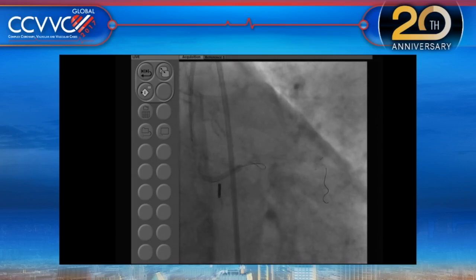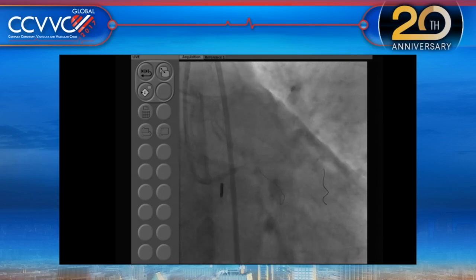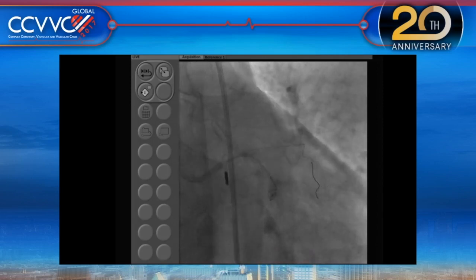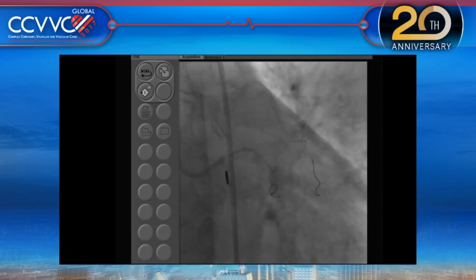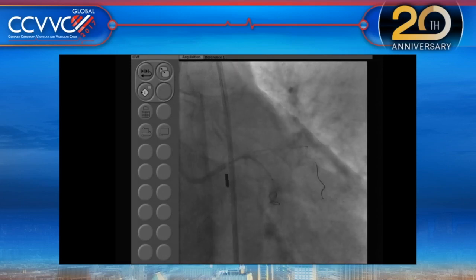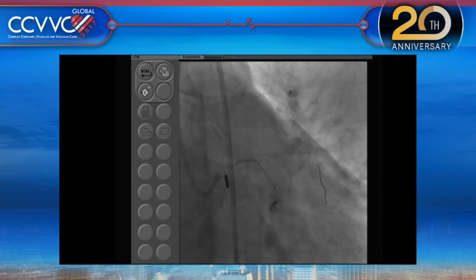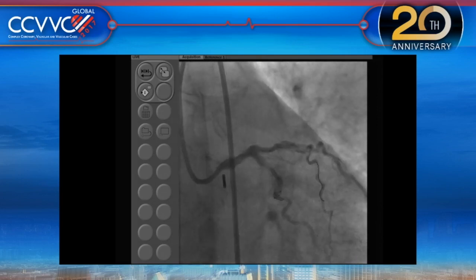Yes. I mean, we all know that the highest restenosis rate is when it involves the circ ostium. Do you have any trick to reduce the restenosis? I think we need to have a little more aggressive debulking. You have opened it nicely. You're right. It has always been the Achilles heel in these bifurcation cases. Some dye here, no. I think this is also too long, very bad.